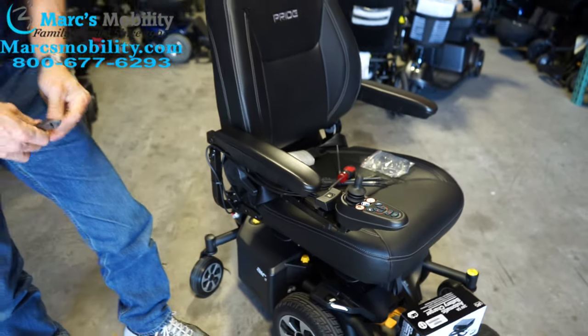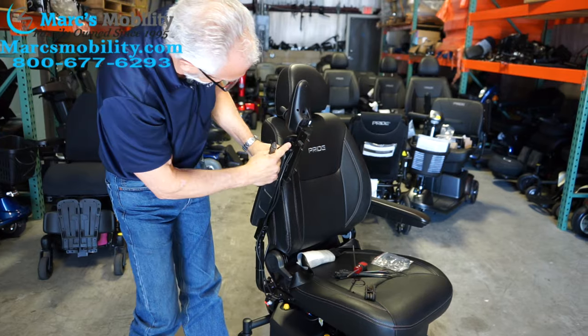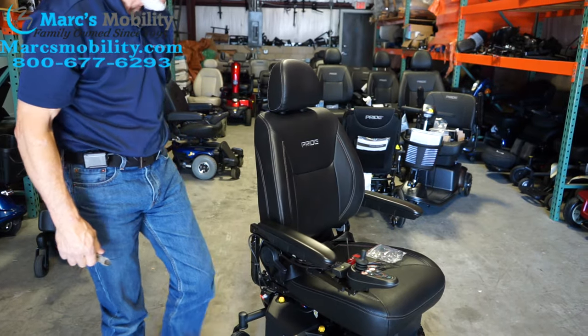So again: two screws on the top, spacer, two screws on the bottom, spacers for the light switch — and that should be it. You should be able to put that on with no problem.